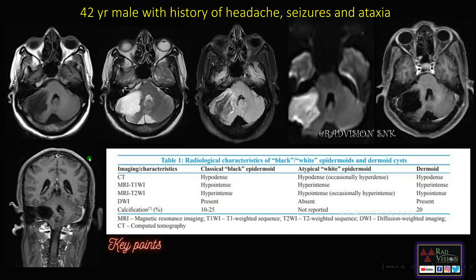Next case: a 42-year-old male with history of headache, seizures and ataxia. You can see there is a cystic lesion noted in the right CP angle which is hypointense on T1, hyperintense on T2, showing incomplete suppression on FLAIR, showing classical restricted diffusion on DWI. There is no significant enhancement on IV contrast. Differentials can be epidermoid cyst or arachnoid cyst, and diffusion weighted imaging helps in differentiating them.